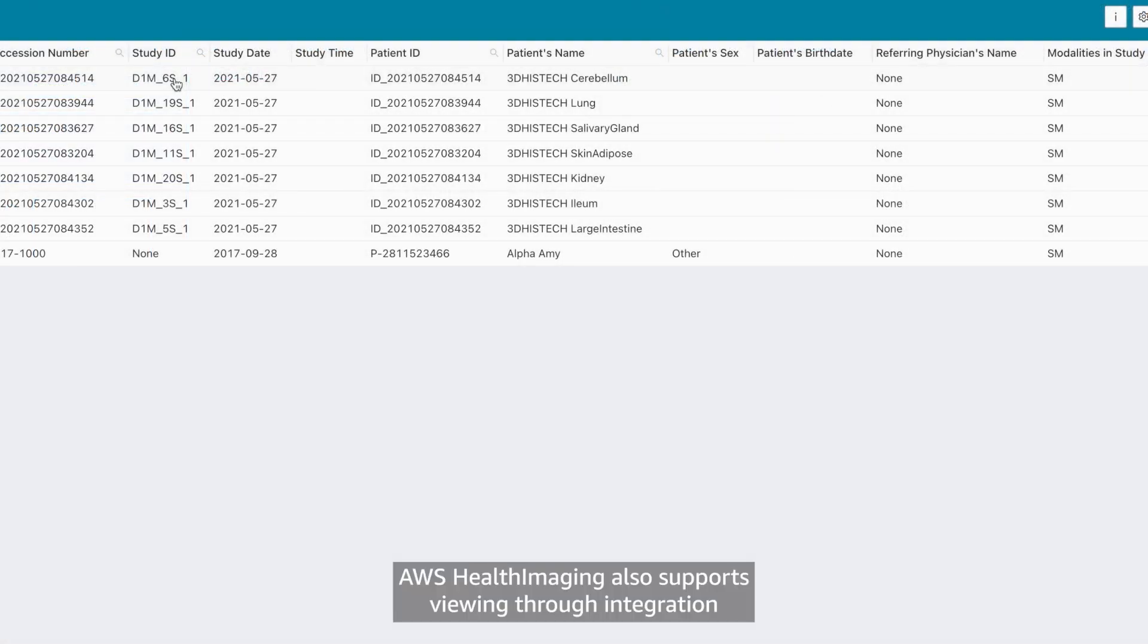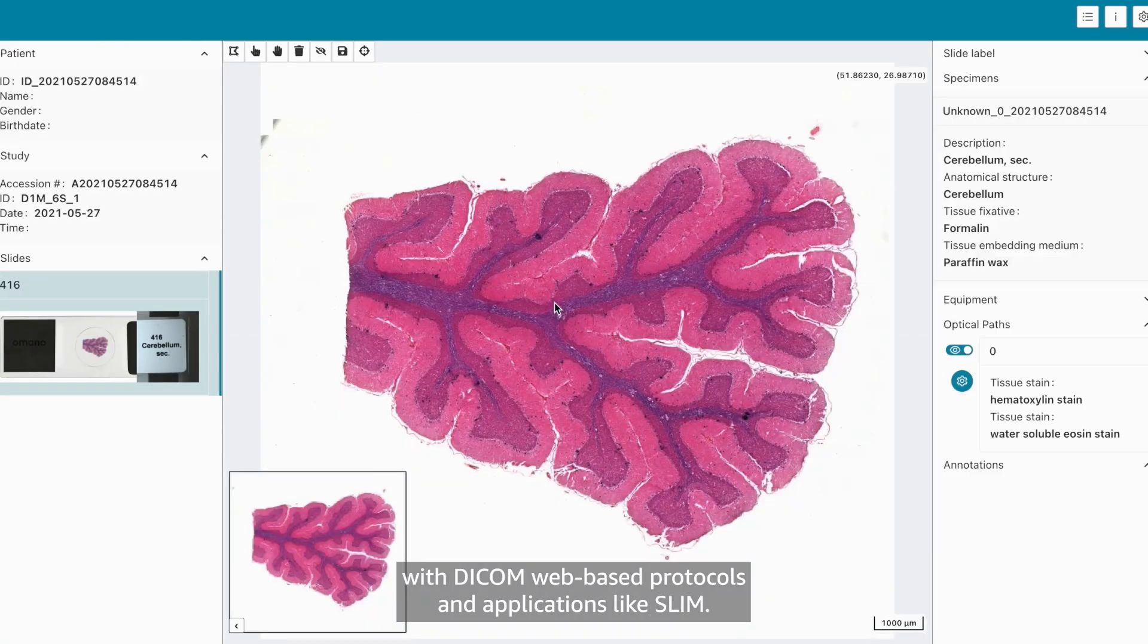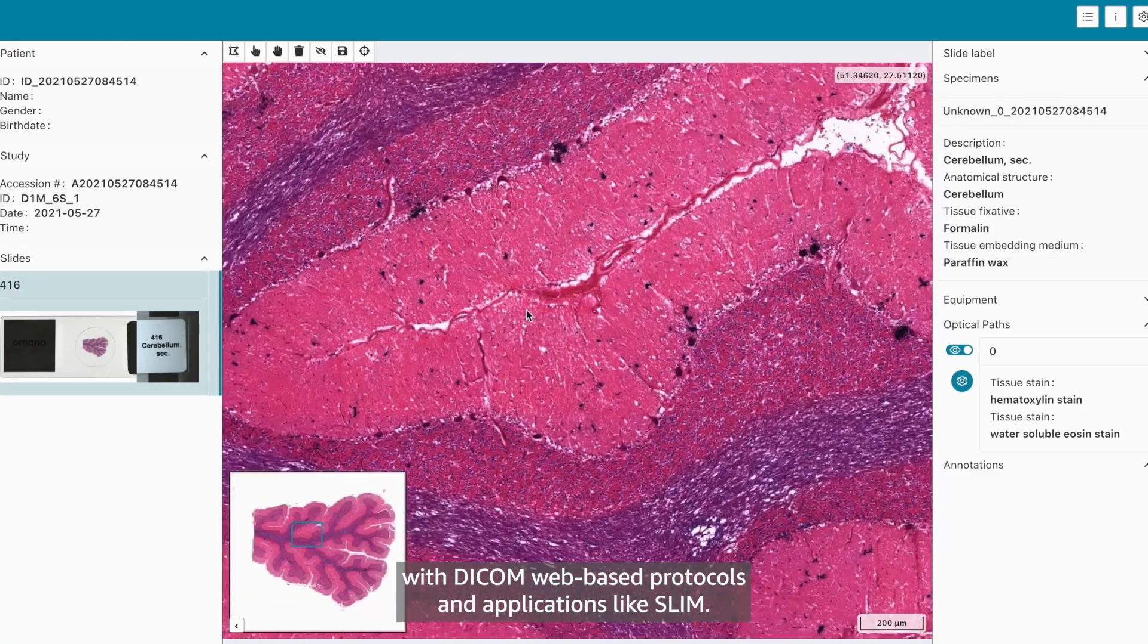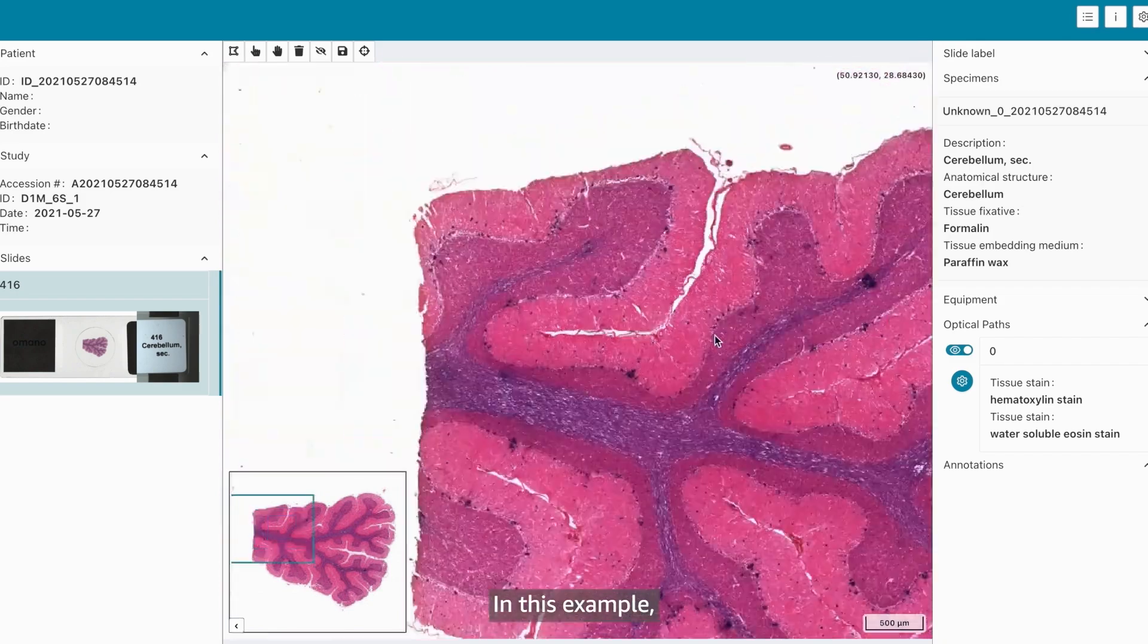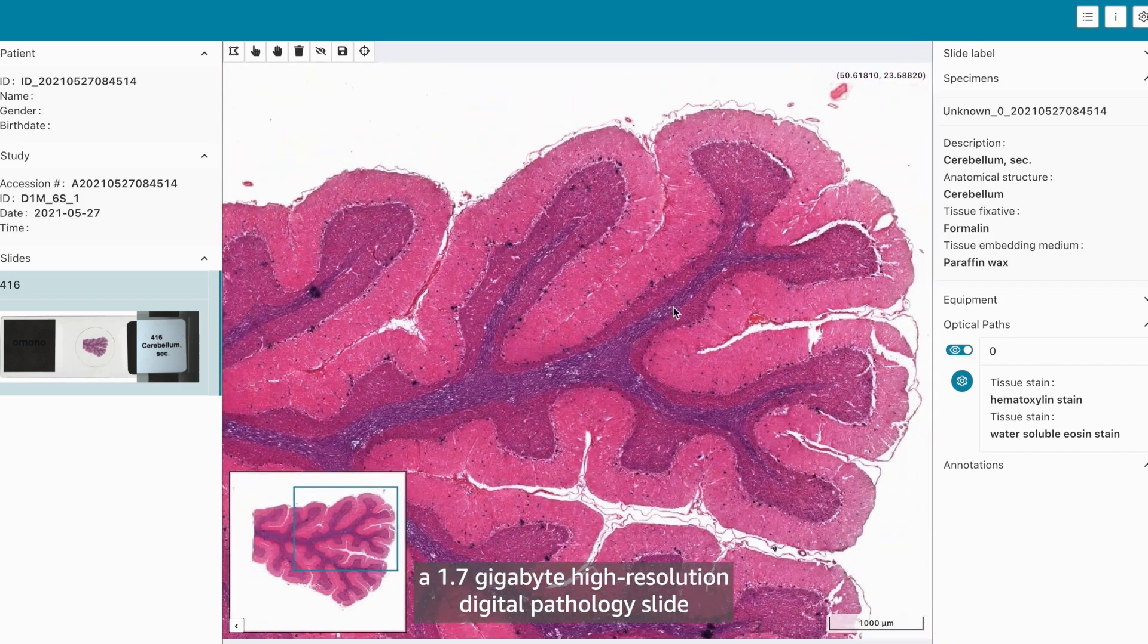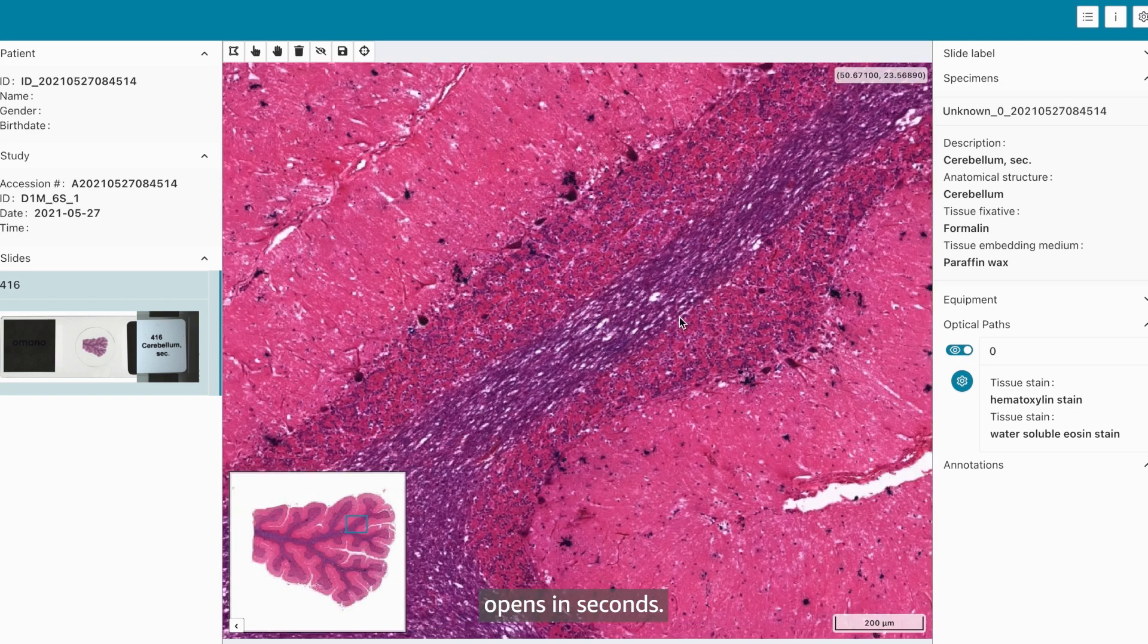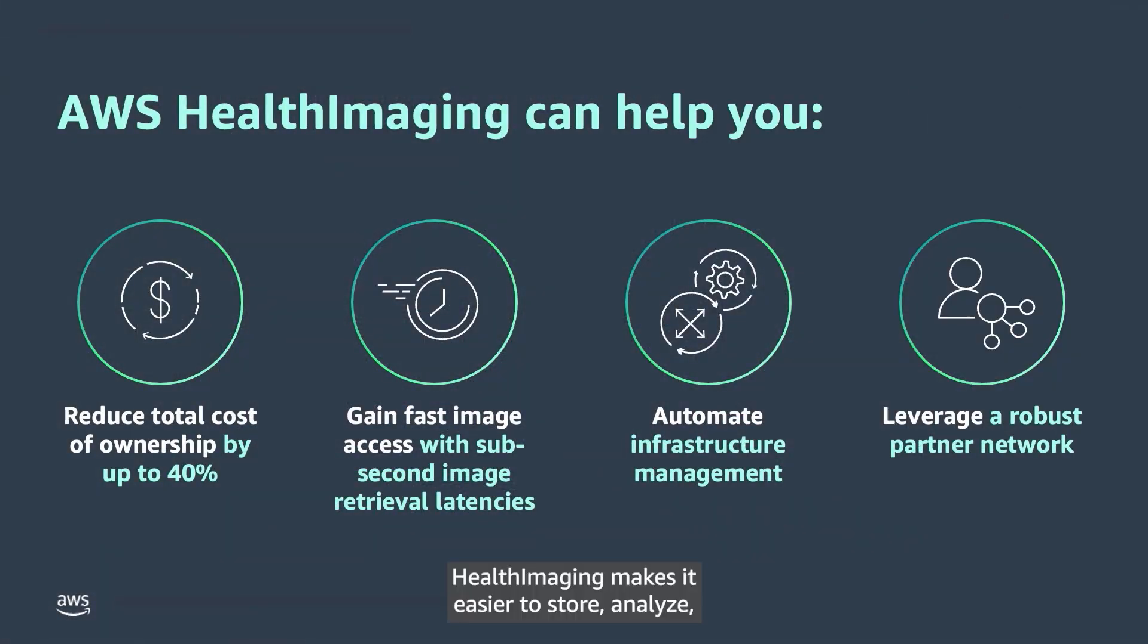AWS Health Imaging also supports viewing through integration with DICOM web-based protocols and applications like SLIM. In this example, a 1.7 gigabyte high-resolution digital pathology slide opens in seconds. Health Imaging makes it easier to store, analyze, and share medical images in the cloud at a petabyte scale.